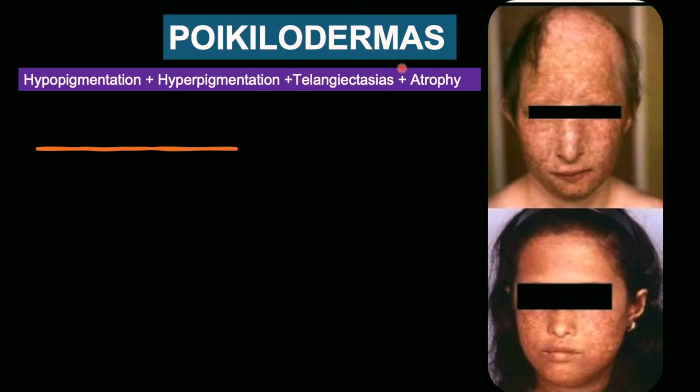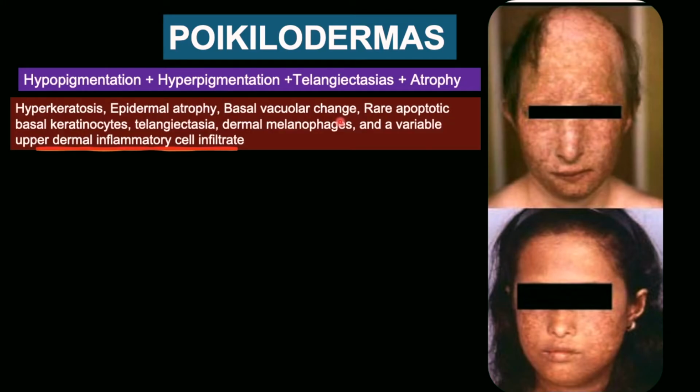And I think the telangiectasia feature is the most helpful along with the other features, because this feature is unique to this type of disease. When you see other signs, it is hard to put all of them together, but the telangiectasias will help you to make that diagnosis.